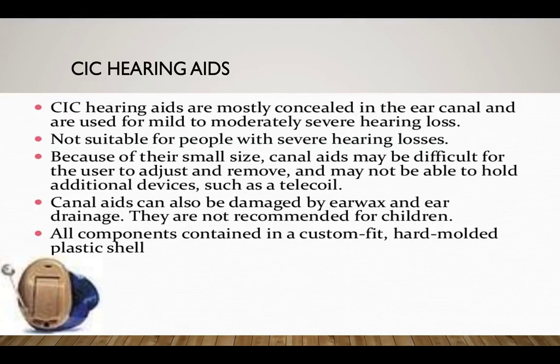And finally, the complete in the canal hearing aid, which is completely inserted in the ear canal, and also can be damaged by earwax and drainage. It is also not suitable and not recommended for children.